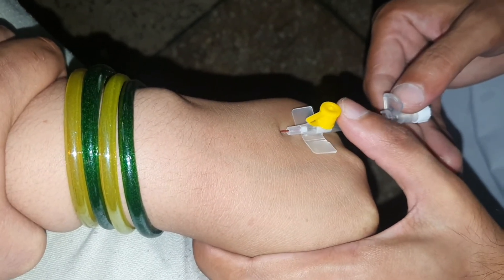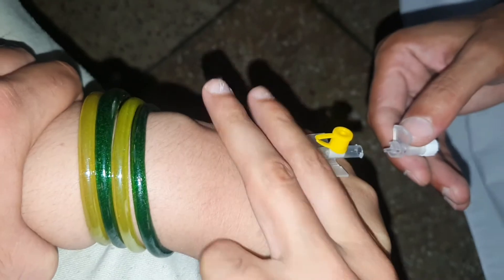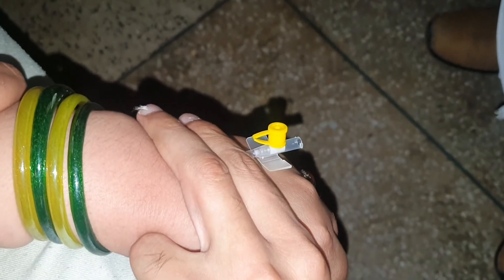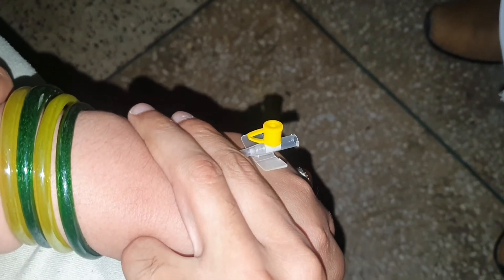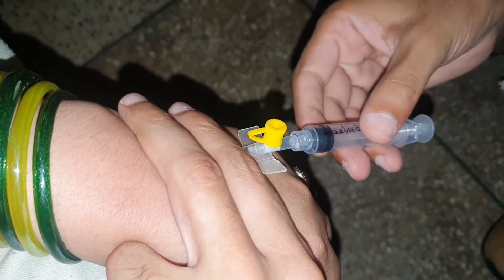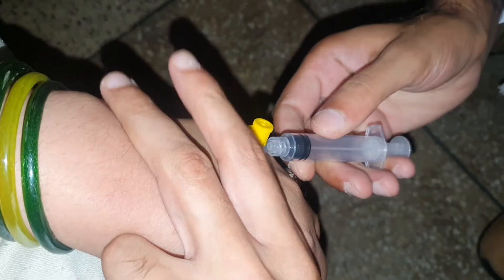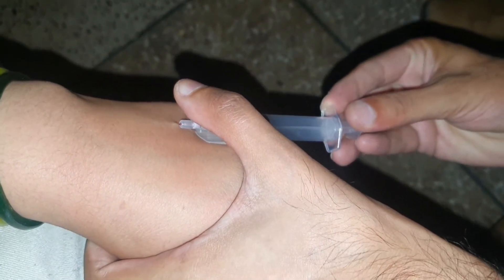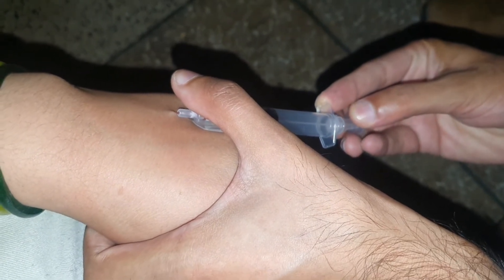Now push the metallic needle outside of the cannula and you have to stop the blood from coming out of the cannula by pressing on the vein.